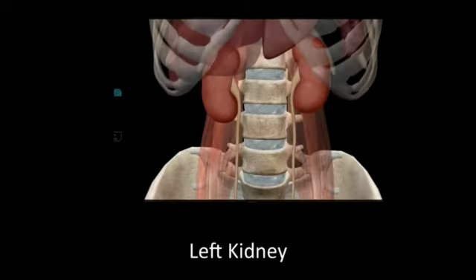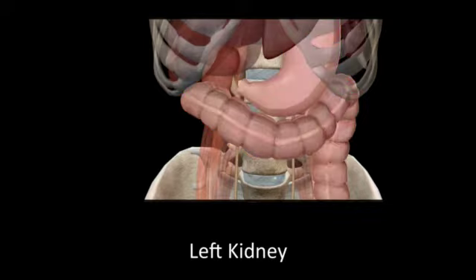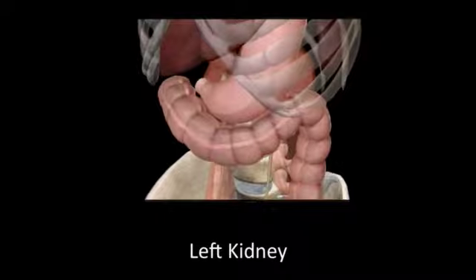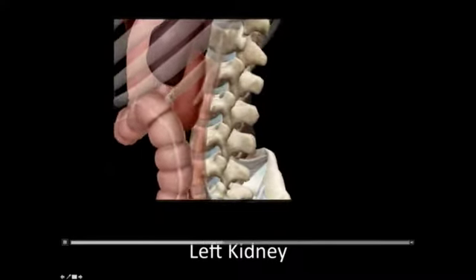Now the left kidney is harder to see than the right, and the reason is that the liver acts as a lovely acoustic window for the right kidney. On the left there isn't a liver, there's a stomach and this transverse and descending colon getting in the way of where the liver would be, and they're full of poo and air and you can't see through them nicely, and so you usually have to go further back on the left to get your view.